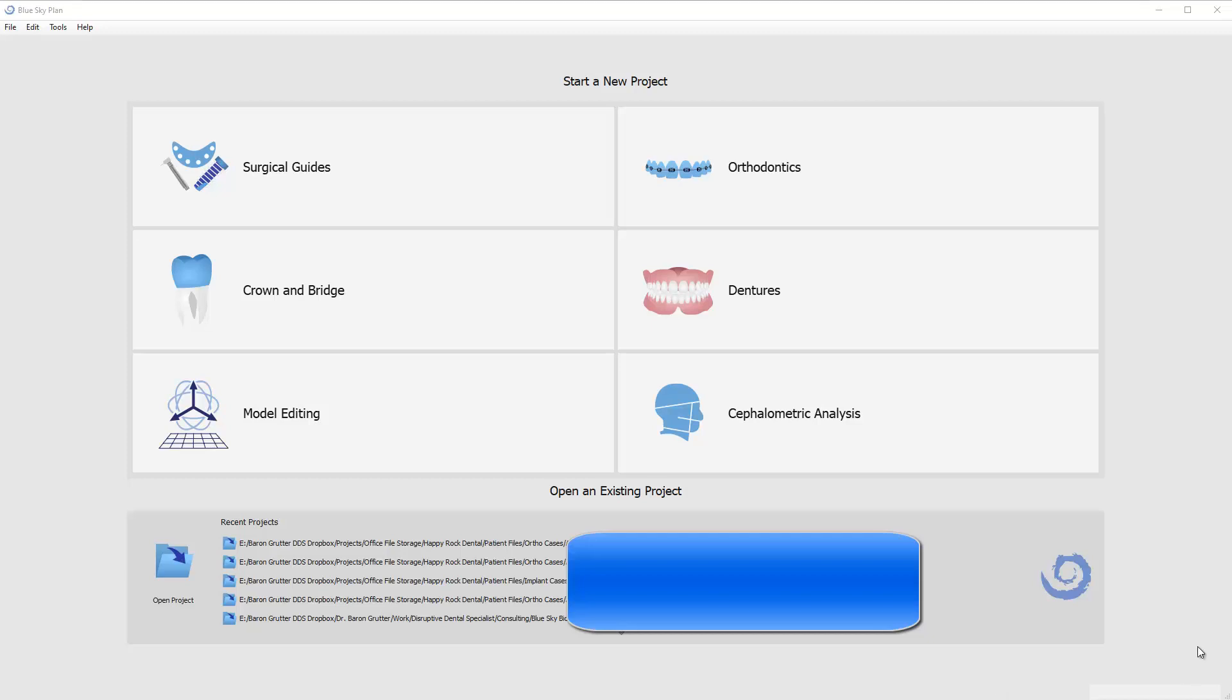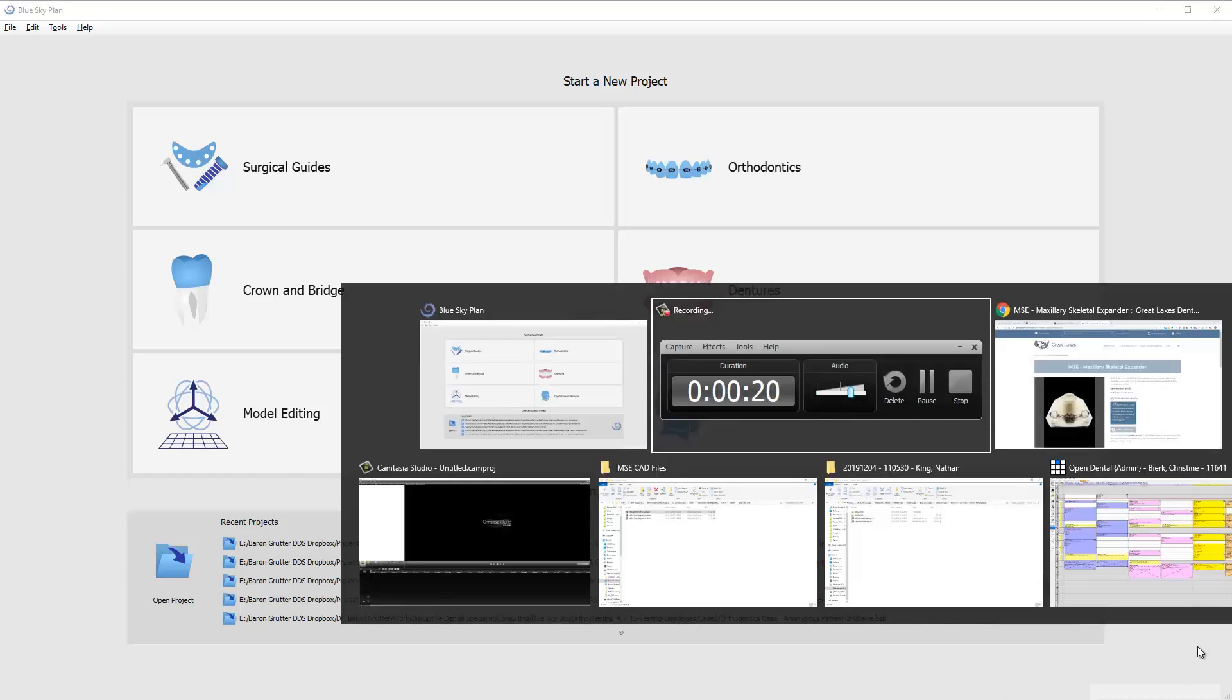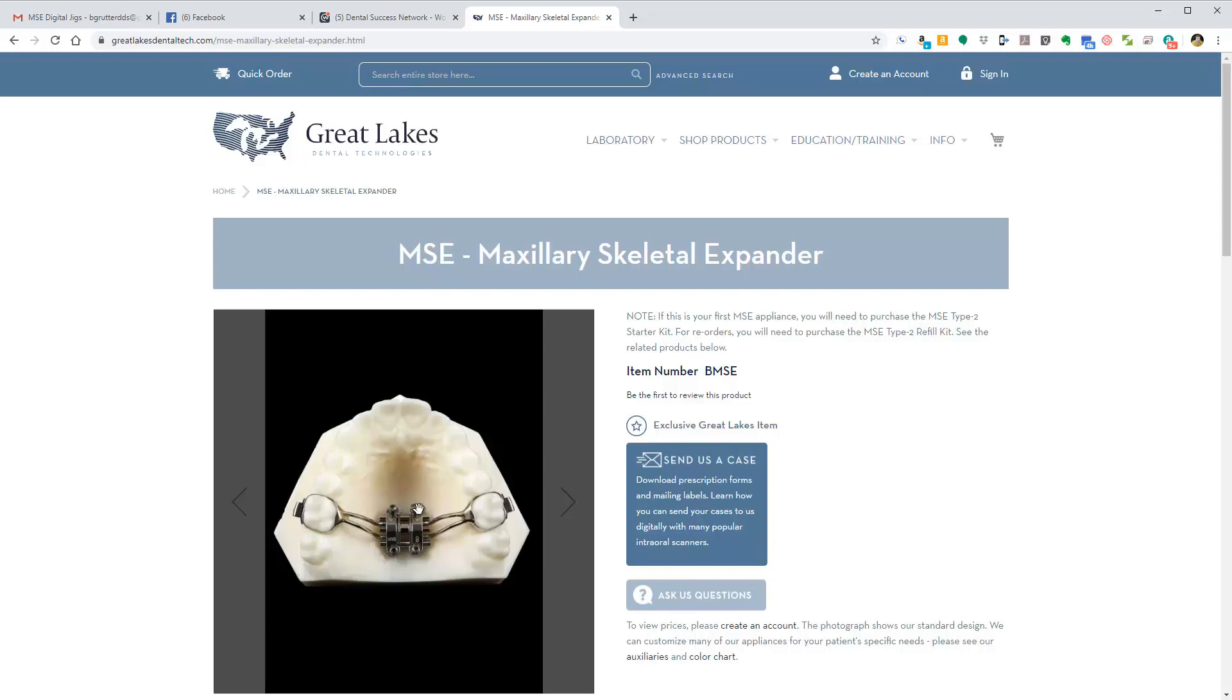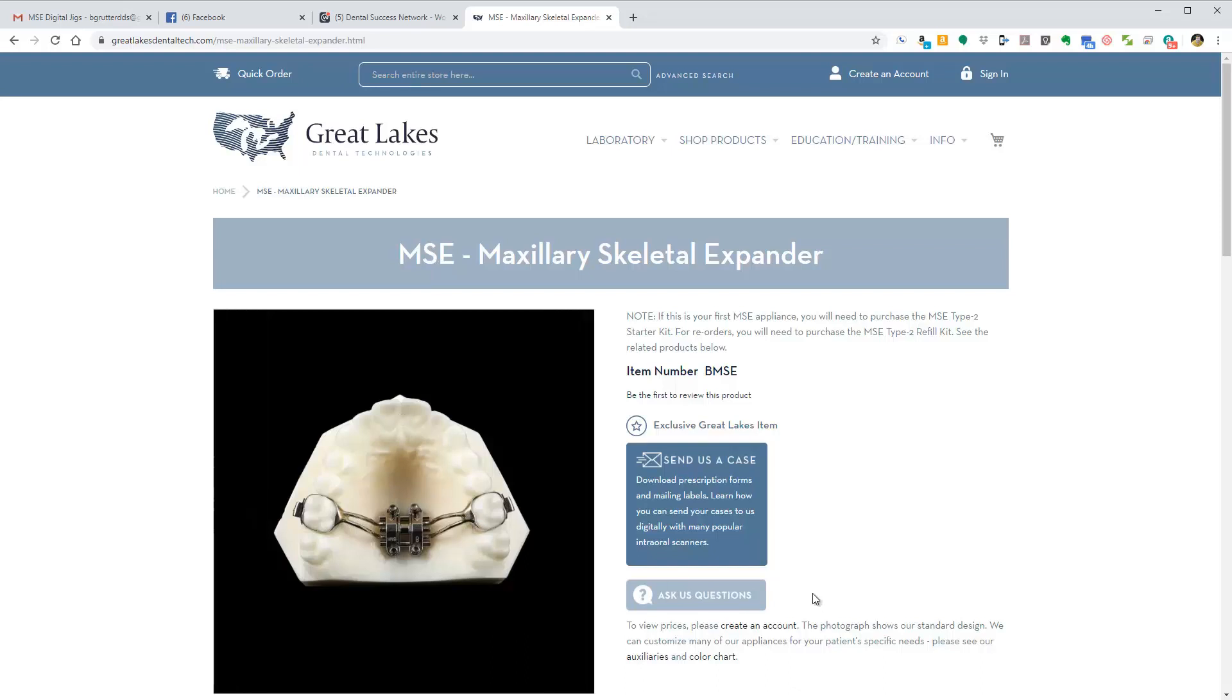To give you a little background, this is what an MSE appliance looks like. It looks like a traditional RPE Rapid Palatal Expander, except it's got four implants that will engage the palate on the underside of the mid-palatal suture so that we can expand. As we expand, the implants engage the actual palate itself and separate the suture to get true skeletal expansion rather than just tipping of the molars.